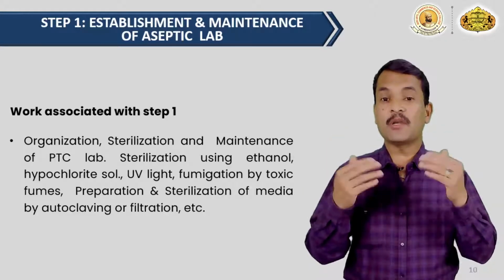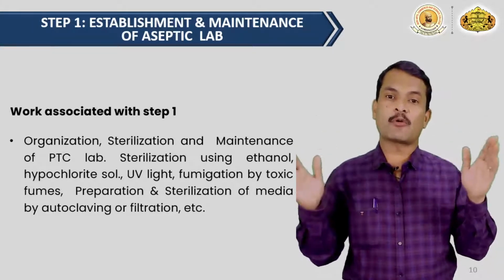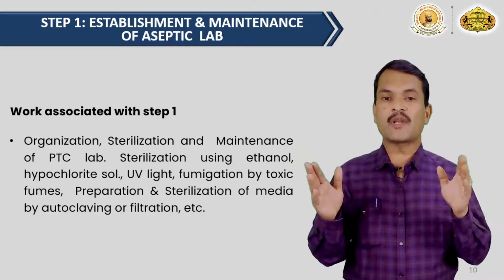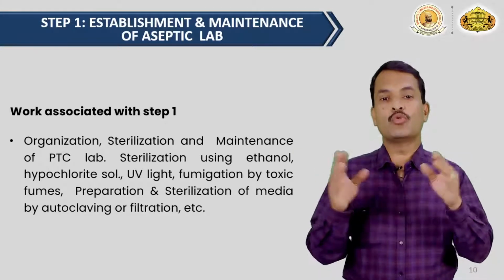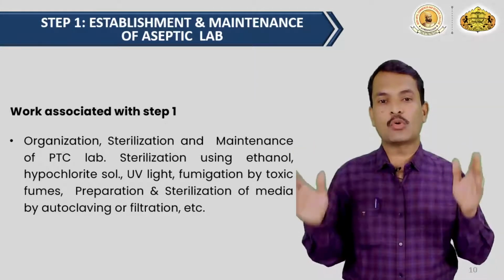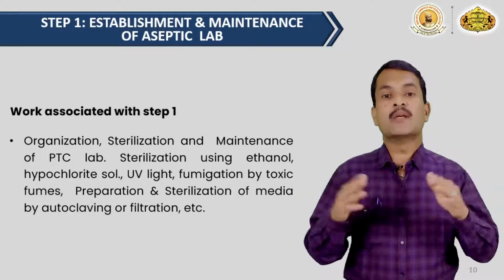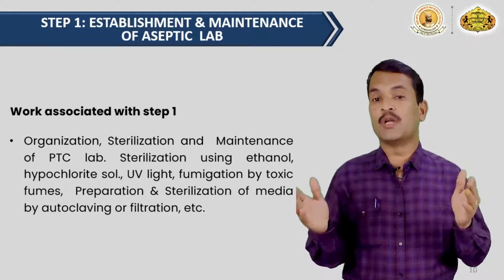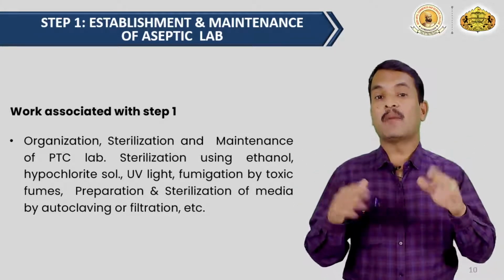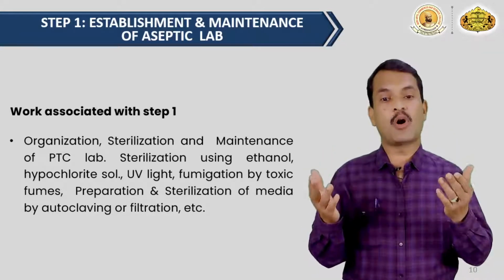So as per your need you can arrange the things. Within the general laboratory setup, you can arrange the washing area, where to store the chemicals, where to store the glasswares, and where to prepare media, right? If there is a separate area, that would be good, for the preparation of the media and for the sterilization of the media. Media sterilization is also a very important thing.